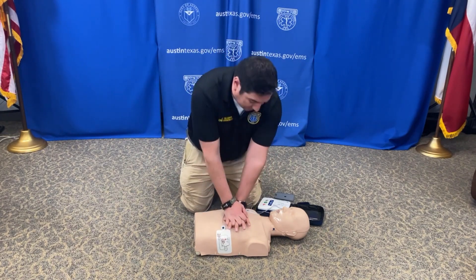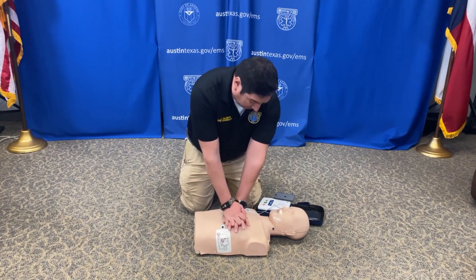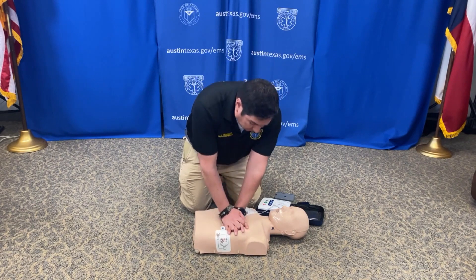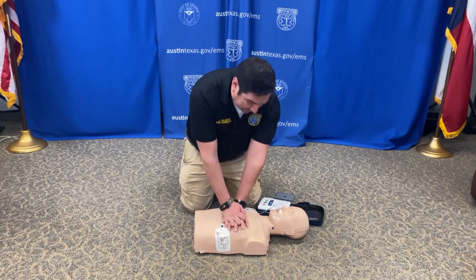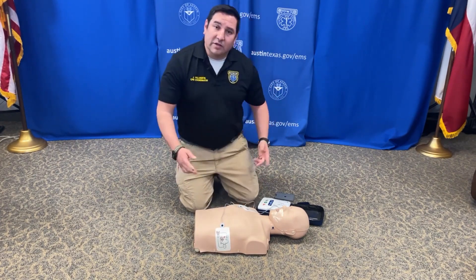Hands go immediately on the chest and begin CPR. Continue with CPR. And if your AED has a little metronome, go ahead and follow that. If you're on with our dispatchers, they will help you keep count as well. They will be with you throughout this process until the first responder team shows up and takes over. And that's it — you just keep going.